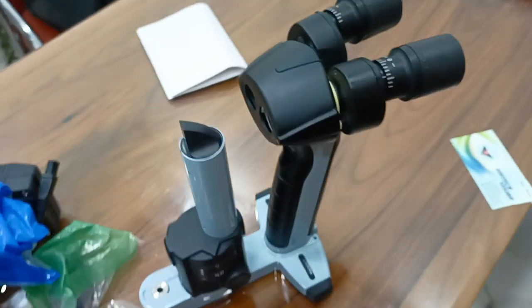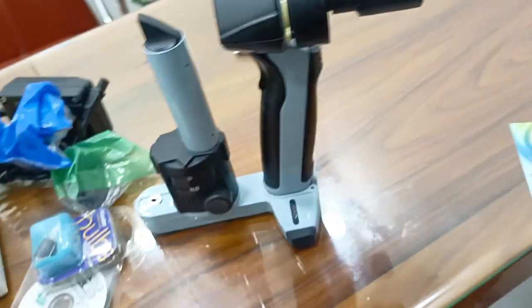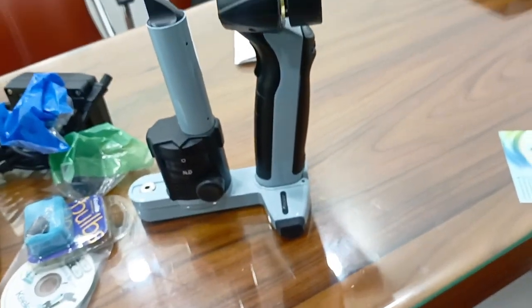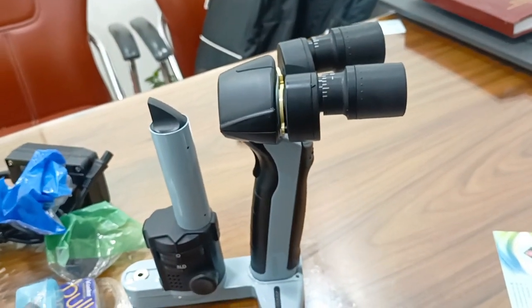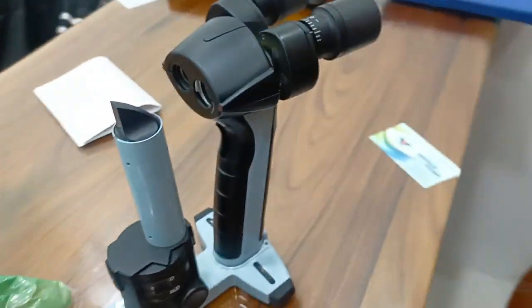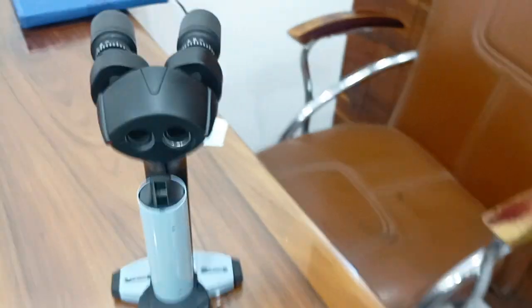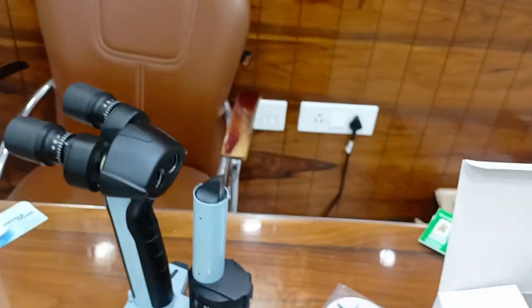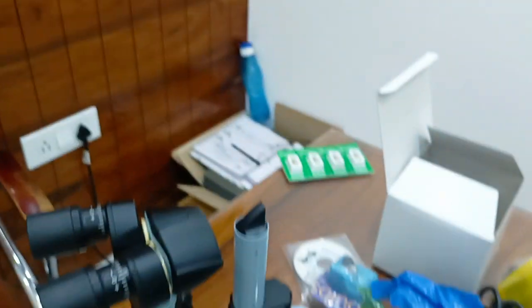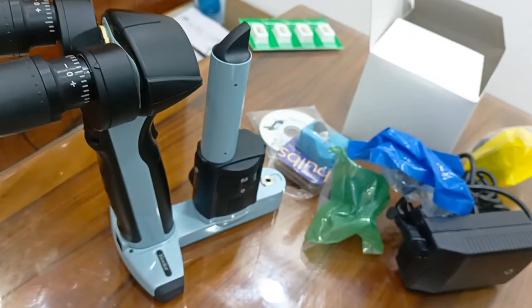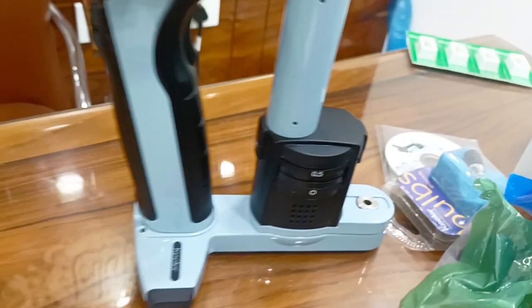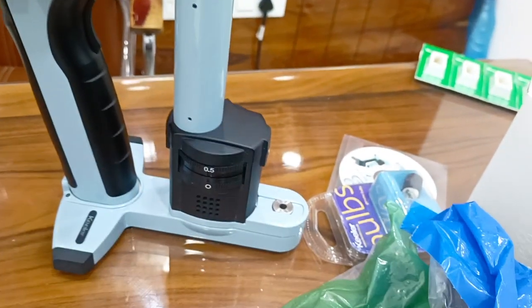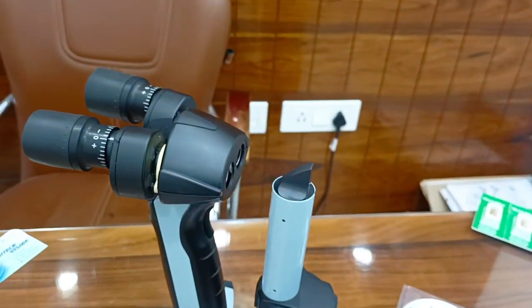You can use this portable slit lamp PSL1 made by Keeler UK very easily. Thank you.